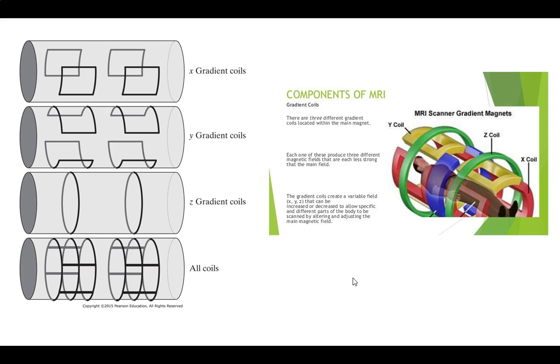Well, let me ask you, what do you think all these gradient coils are used for? The strength of the magnetic field determines the... starts with L. Yes, the Larmor frequency, which is how fast it spins. And that's how we're going to do spatial encoding. Because we can now create these ramps, we can cause things to rotate at different speeds depending on where they are physically. Then when you do a Fourier transform, you're going to resolve out all those physical things. So we're actually going to measure all of them in a range, and then we separate the frequencies out, and boom, you're done. So these are kind of essential for that area.